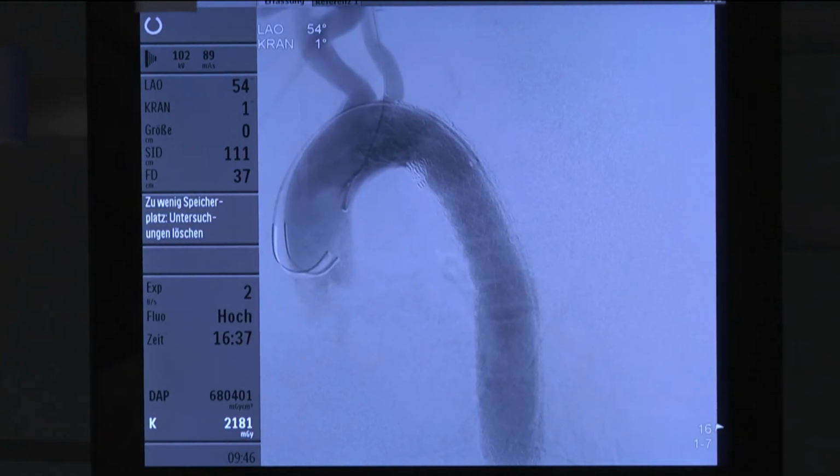We're going to use the ultrasound to verify this at this point. We have a nice positioning in the aortic curvature over the arch, and we have seen that even in this very steep angle, you can use this stent graft to overcome this problem. Like I said, technically it's driving the stent graft to its technical limits, but I think this is an acceptable result.